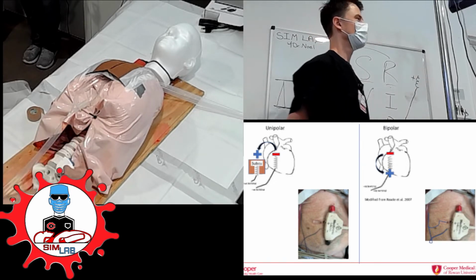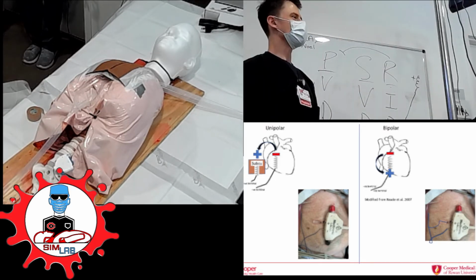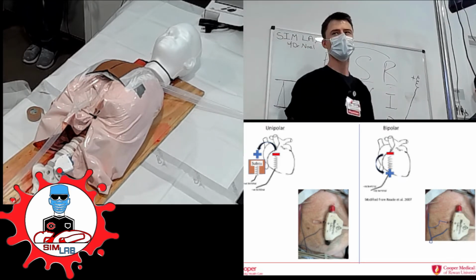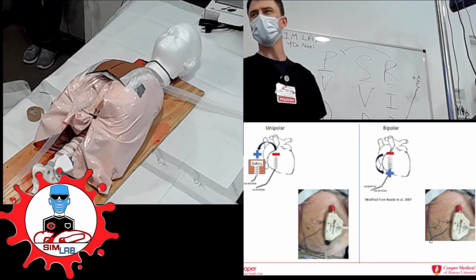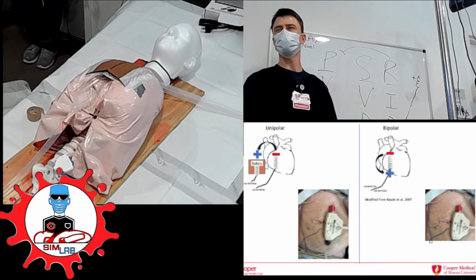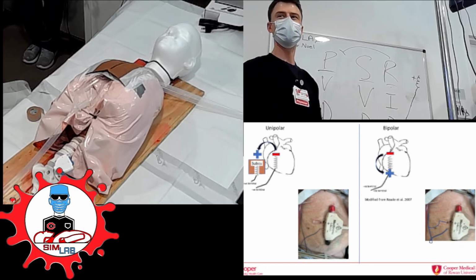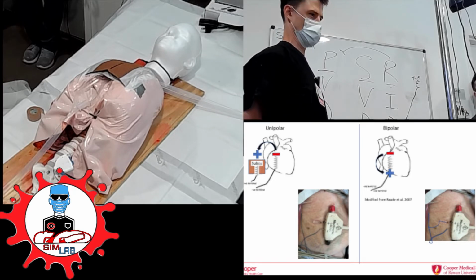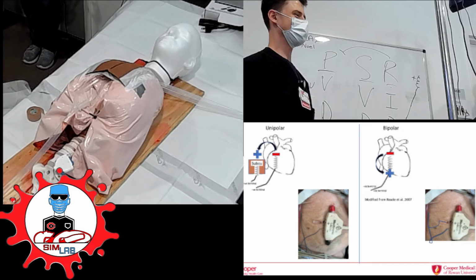How does that work to get capture? Why? Yeah, I'll give you a good answer for that. Sometimes it just works, like unplugging and plugging back in. It's like anybody old enough to have a Nintendo: you take it out and blow in the cartridge. We do all that to try to get these things to work again. Okay, it didn't work. No. Oh god. Still asystole.